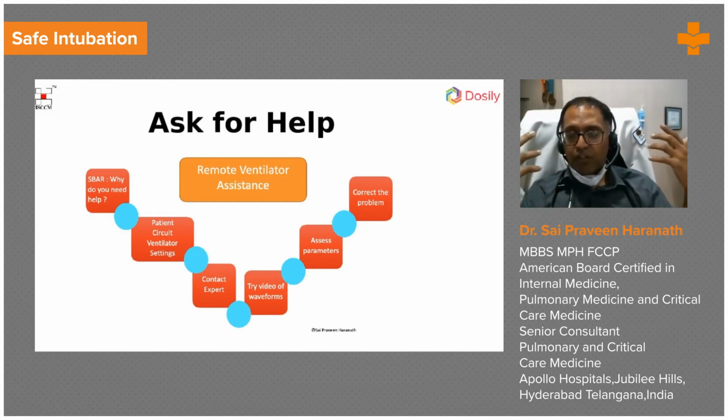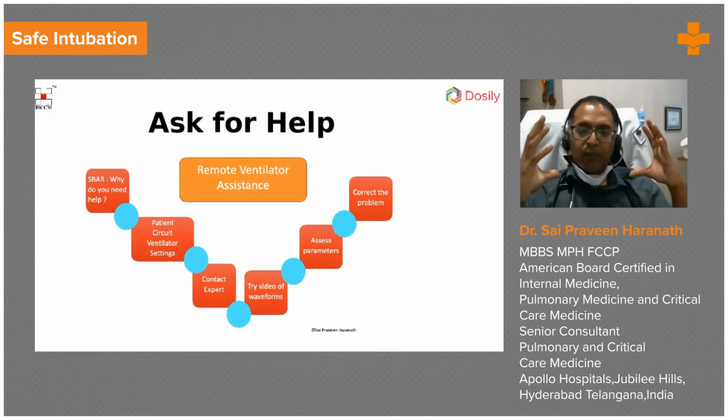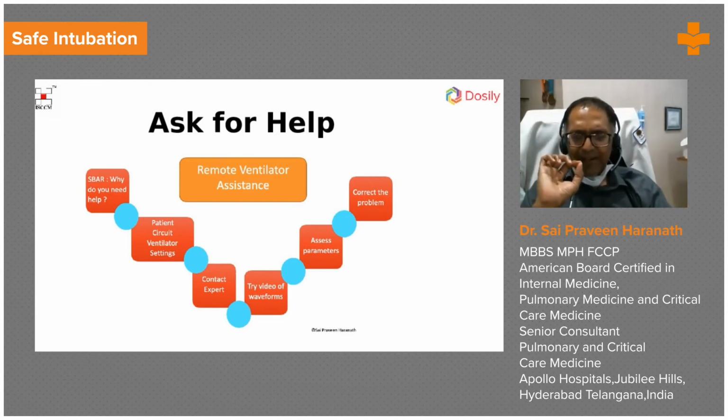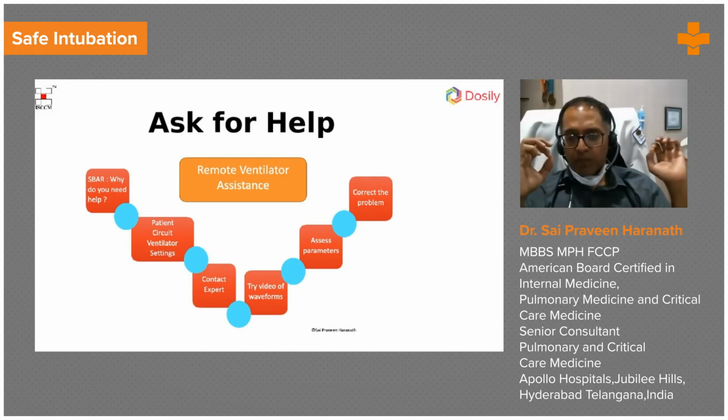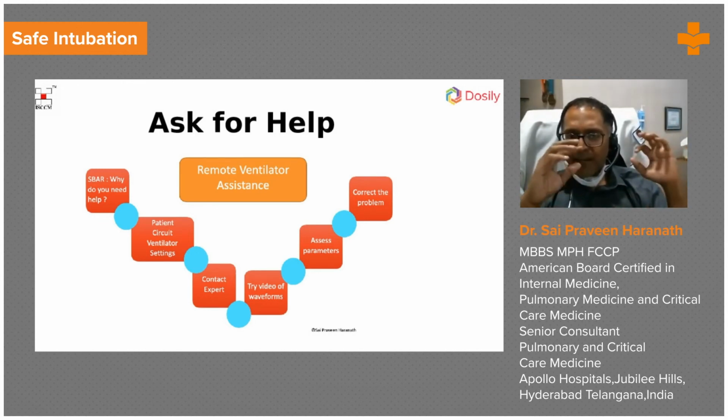These are all high pressure, critical situations where you need to practice. A course like this is something that will give you the mental framework to assess the patient adequately, from the ventilator to the patient to the circuit, to give an adequate rapid response to the situation. Assess all the parameters. Is the oxygen level adequate? Should you make the FiO2 100% while the problem is being corrected? And ultimately correct the problem and then get feedback as to why this happened.